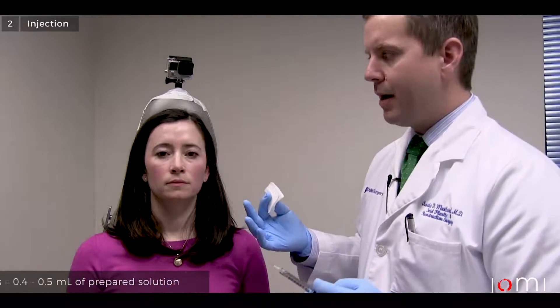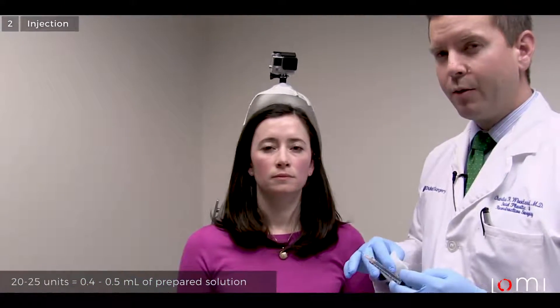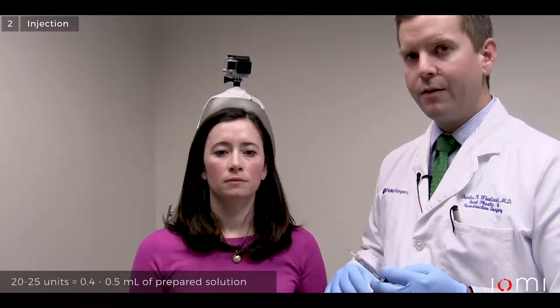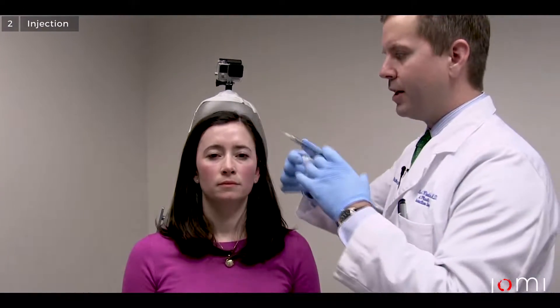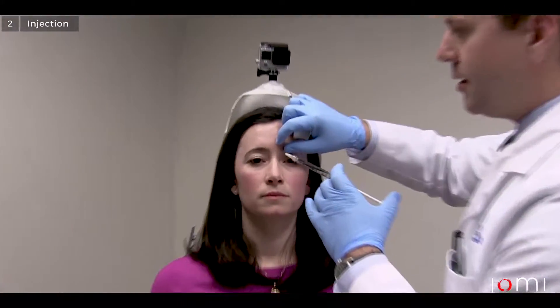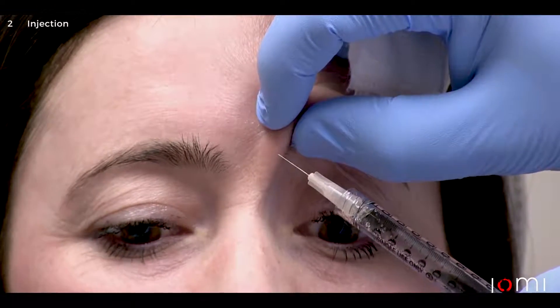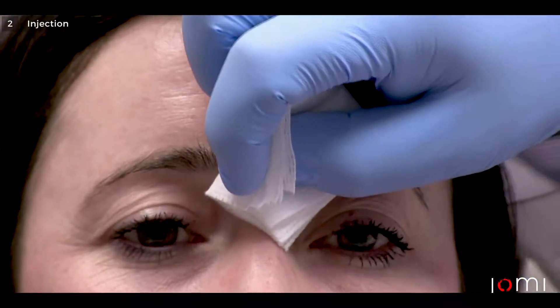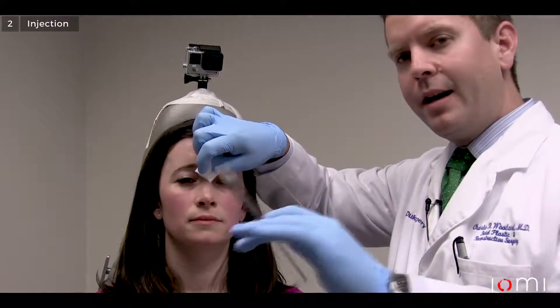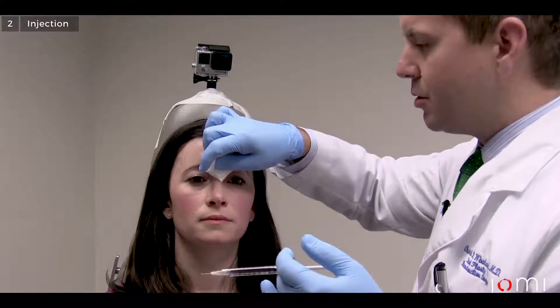For typical treatments in the glabella region, we're probably going to need a lower concentration for her because we didn't have a whole lot of corrugator activity — approximately 20 to 25 units. I tend to inject those in 5-unit aliquots in the central region of the face. I'll pinch the brow in this region, remind the patient to breathe, and then a small stick here. You want to put the product in at around 90 degrees — you don't want to come in at a tangential angle because you're trying to place the product directly in the muscle you're trying to affect.